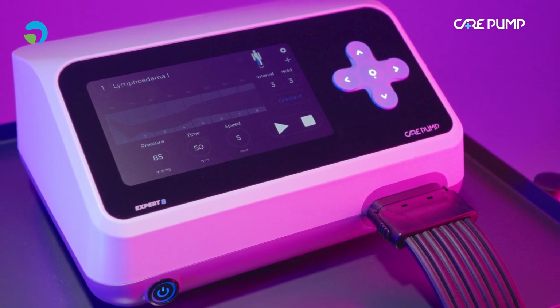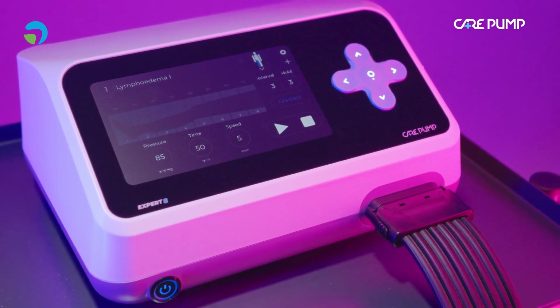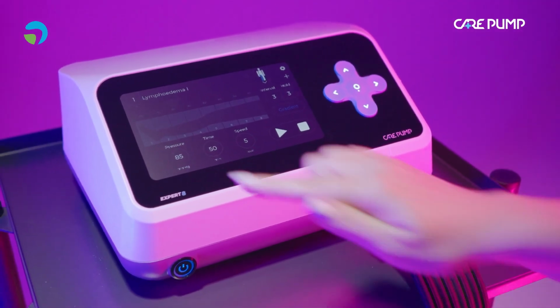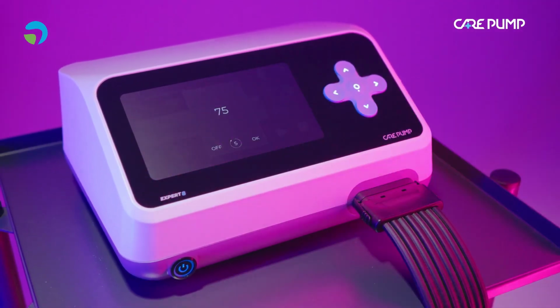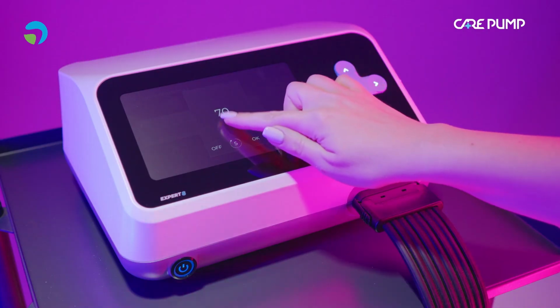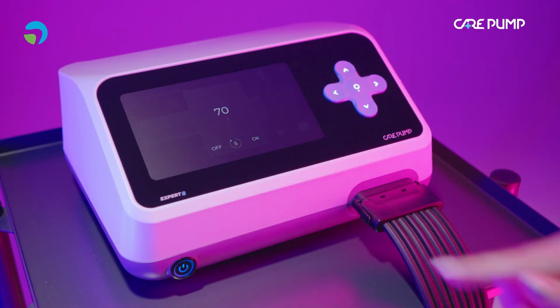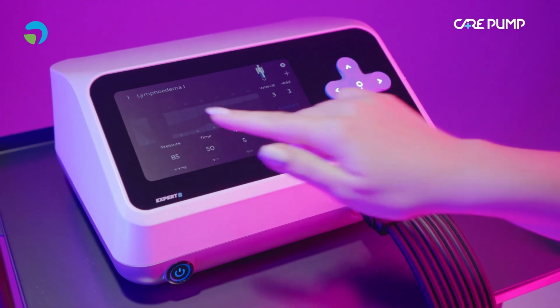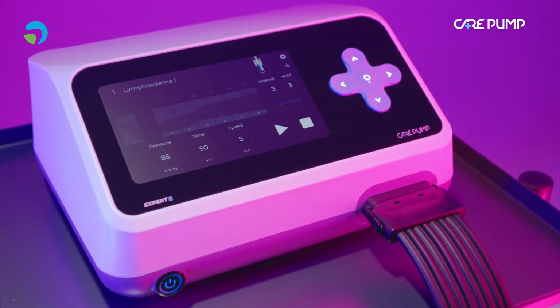You can check the pressure value for each chamber on the cuff visualization. To change the pressure for the selected chamber, touch the corresponding area and by moving the values on the list up and down, select the appropriate value. It cannot be higher than the pressure in the previous chamber. To turn off the chamber, press Off. The switched off chamber will not be highlighted.